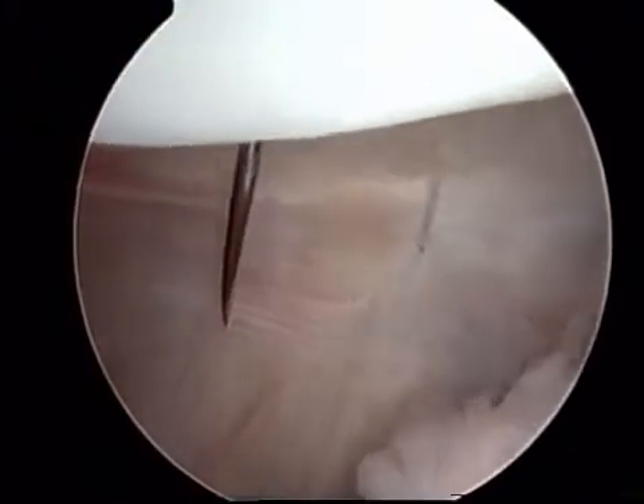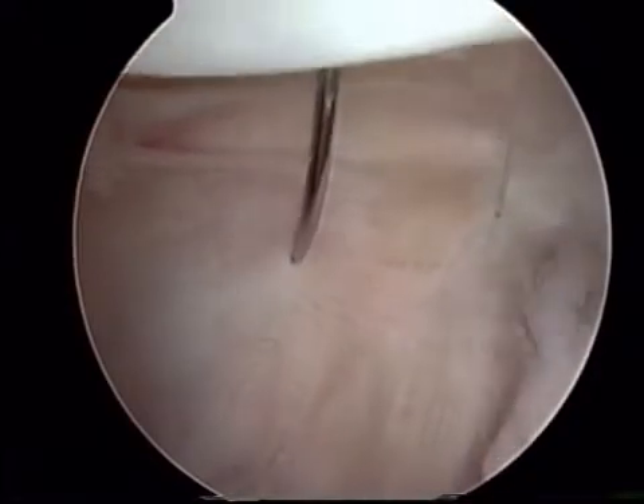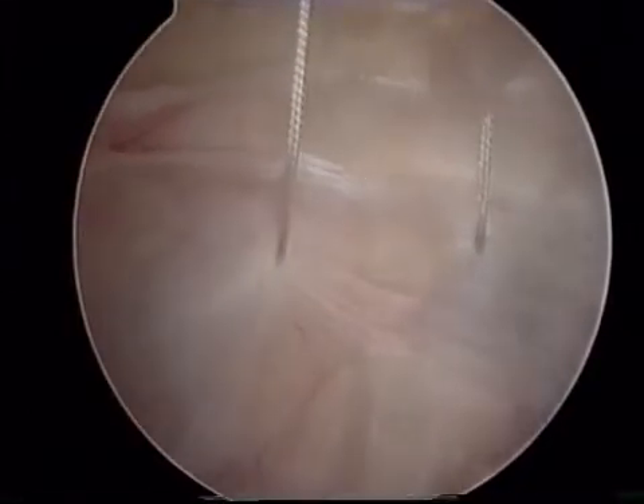Once all of the sutures have been placed, tracking is then reassessed. In this particular patient, a distal procedure was felt to be beneficial. After the arthroscopic procedure was finished, she had a realignment of her patellar tendon distally and has continued to do well after this procedure.